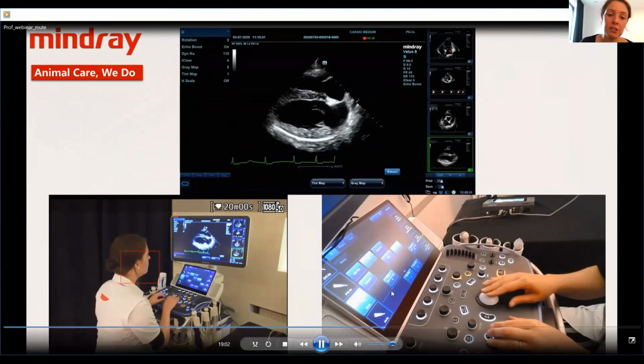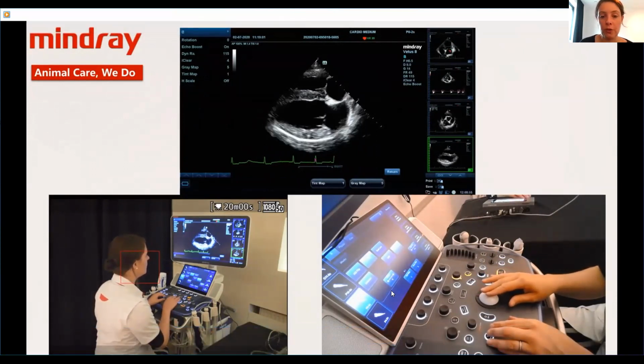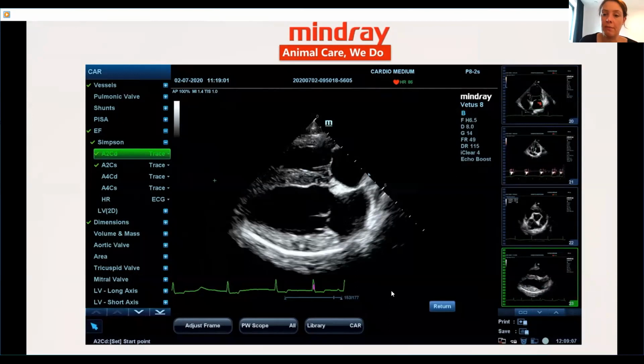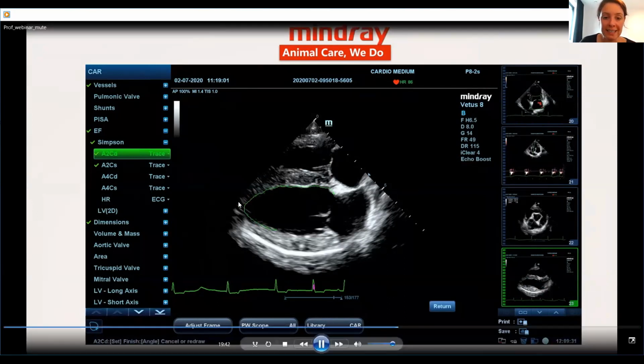One of the 2D images that you can do on your right parasternal 4-chamber view is a volumetric measurement to look at the volume of the left ventricle. This is not an easy measurement. I do this now because I have my fixed order, and I start with this and then I move on to the next measurements. But if you're a beginning echocardiographer, I would advise you to just start with the M-mode images. You have to make very good long axis views if you want to correctly measure the volume, because what you actually need is a good delineation of the apex.